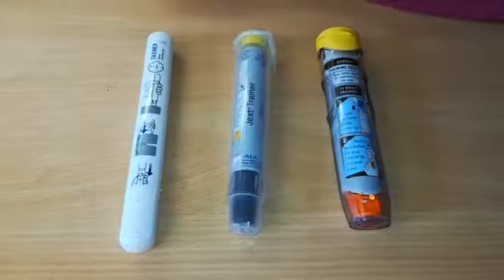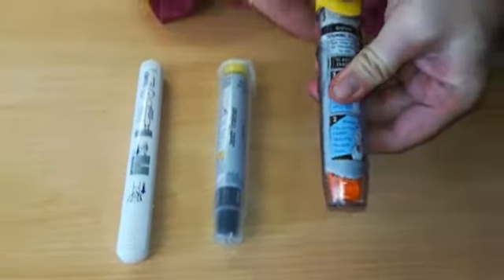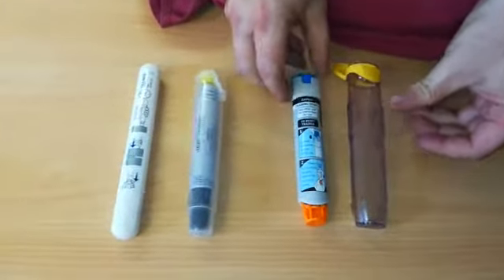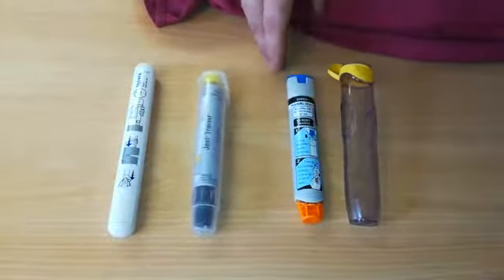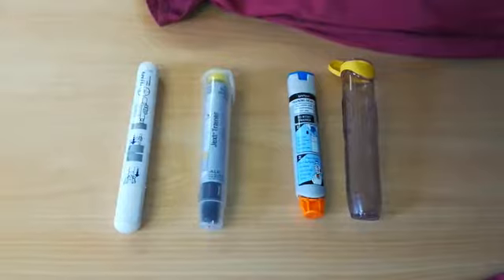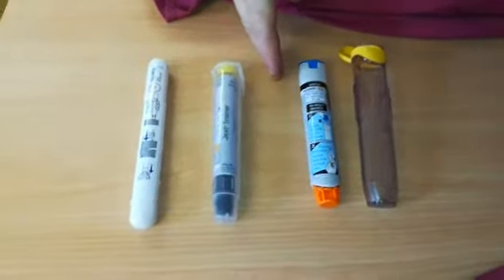Most people will have known the EpiPen. It comes in its plastic case — this is a trainer, it's got a blue lid. It comes in an adult and a child version. The adult dose is 0.3 milligrams in a 1 in 1000 solution, and the child dose is 0.15 milligrams in a 1 in 1000 solution.